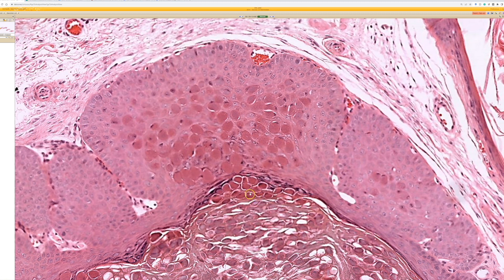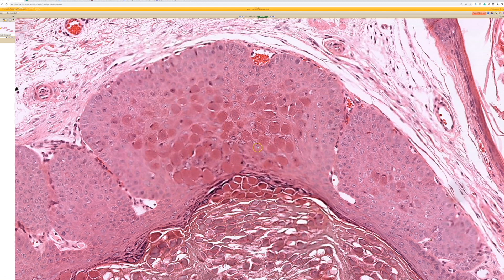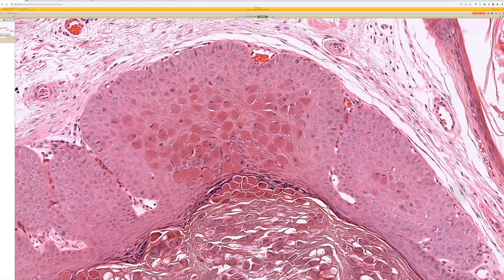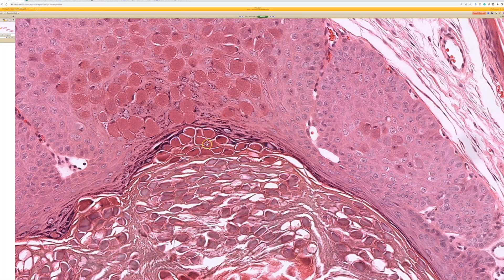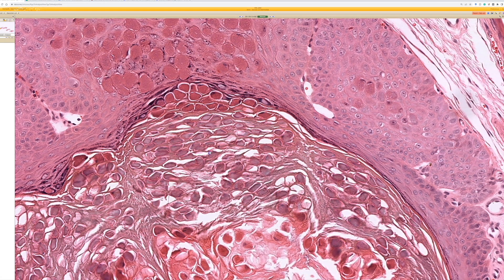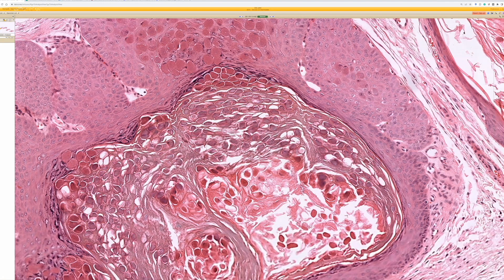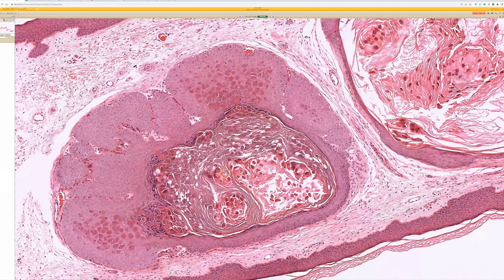Henderson-Patterson bodies — Molluscum bodies. These pink, kind of uniform granular-looking aggregates of viral particles are expanding the cytoplasm of the keratinocytes, and eventually getting sloughed off into the keratin, either on the surface of the skin in the stratum corneum, or here into the cyst contents.